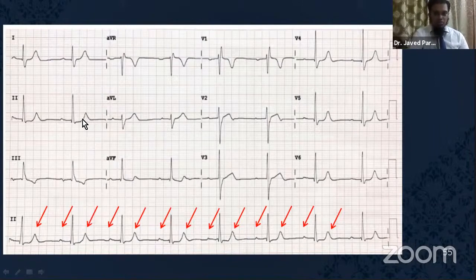If you see such pointed T waves, if you see carefully in V2, the T wave is biphasic. So the biphasic T waves are always abnormal. So either there is a P wave hidden in them or there is ischemia going on. So if you carefully map these patients, mark these P waves and carefully see, this is a 2:1 AV block and the conducted PR is long.